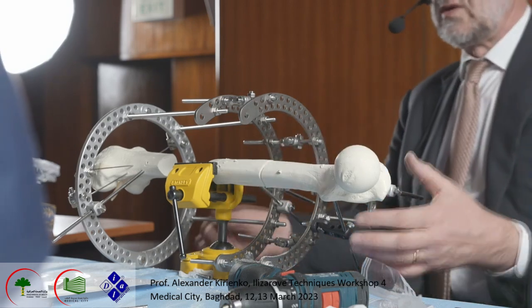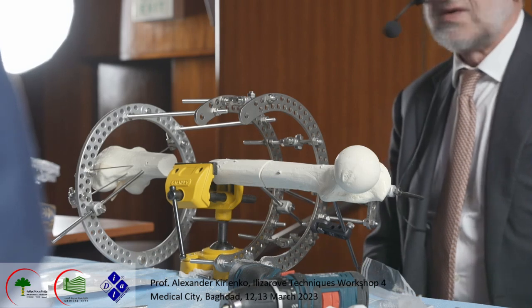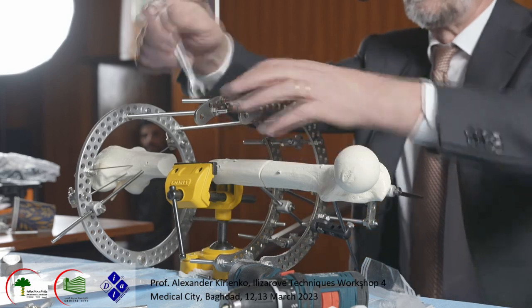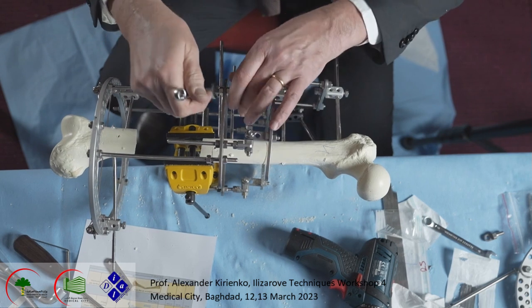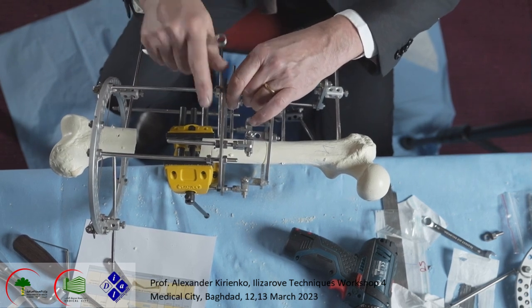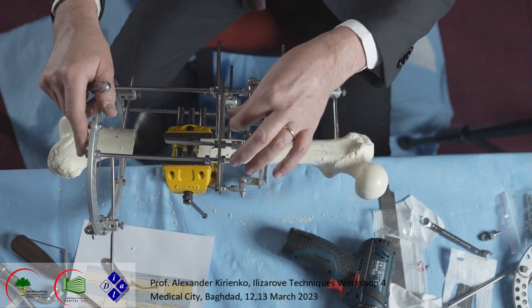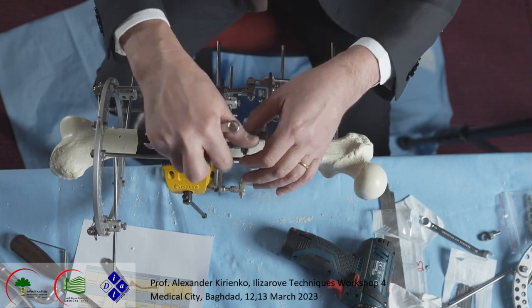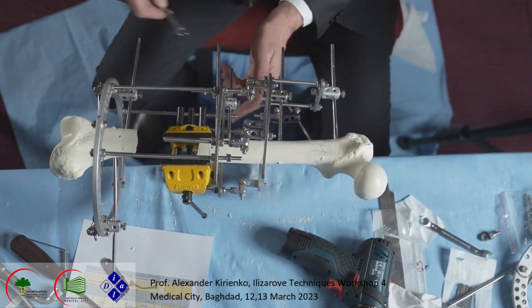Okay, like you see now, we are practically ready to do the bone transport. Like we explained before, I shorten it here, slowly. You may do it distally or proximally, where you're more comfortable. We short here. We do progressive shortening.